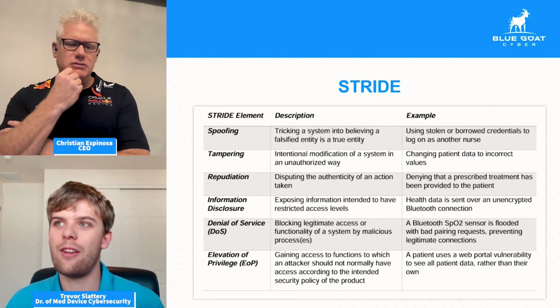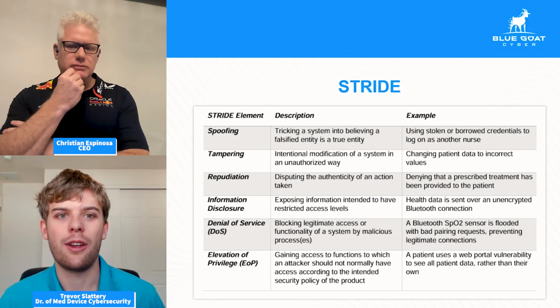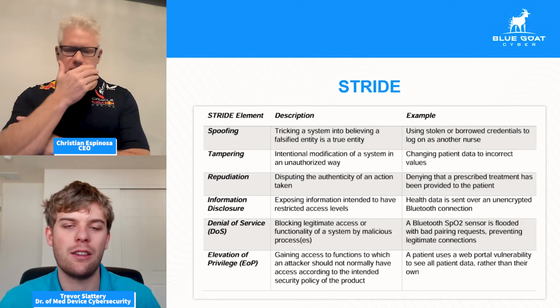Exactly. And so that's usually going to be one of the big concerns. Often traditional cybersecurity is broken into confidentiality, integrity, availability.